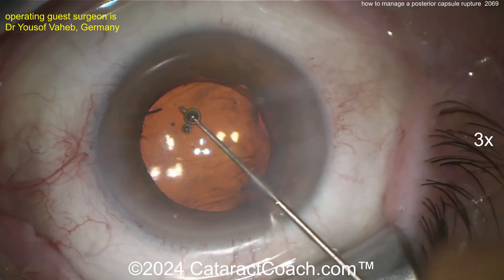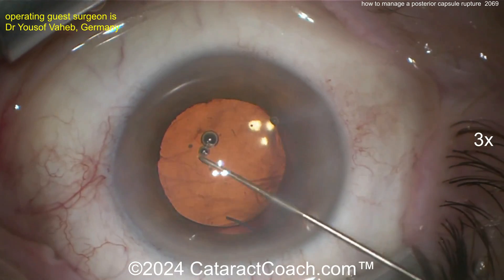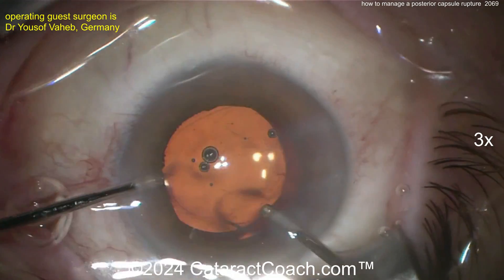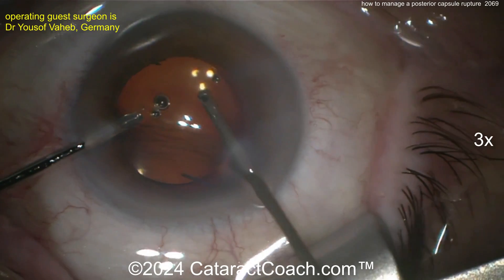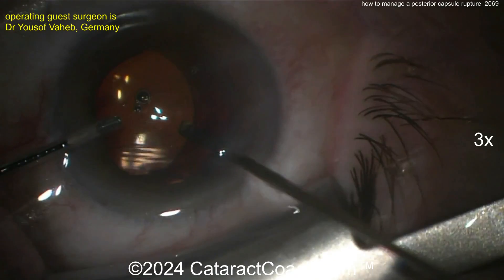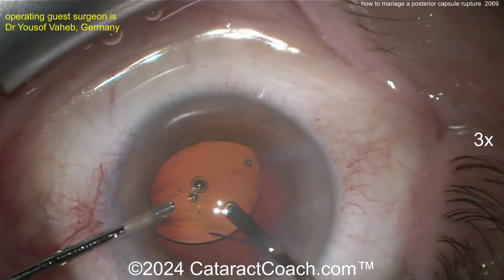If you can get an optic capture, what do you do with the IOL power? You can calculate it for in-the-bag placement because the optic is behind the anterior capsule. However, keep in mind your three-piece lens may have a different A-constant than your single-piece lens, so in most cases you'll drop the IOL power by about a half diopter due to the difference in A-constant. If you're placing the entire lens in the sulcus — optic included — you've got to use the rule of nines, because the effective lens position in the sulcus is more anterior than behind the anterior capsule, and you still have to account for the A-constant difference.